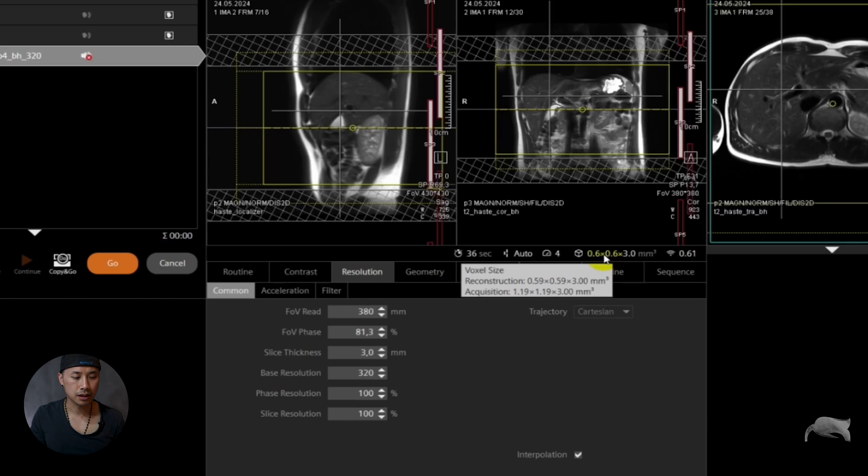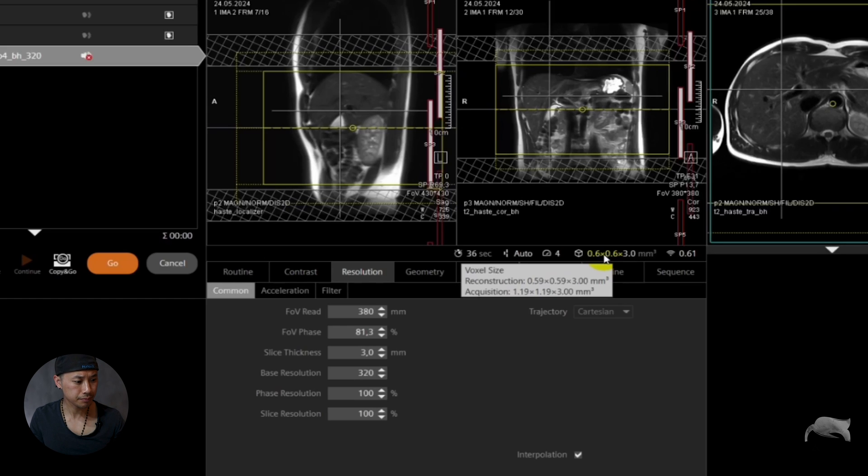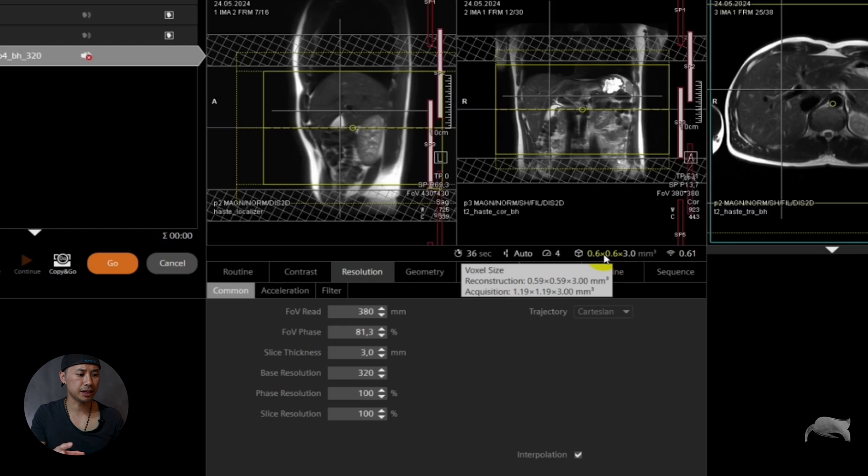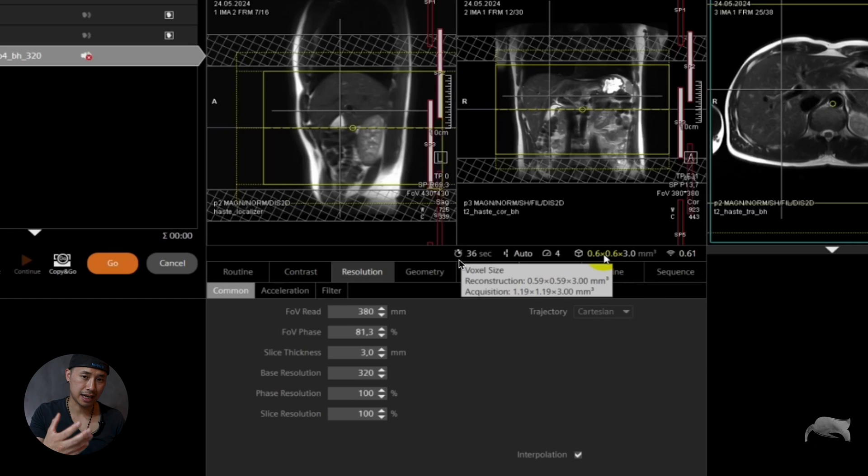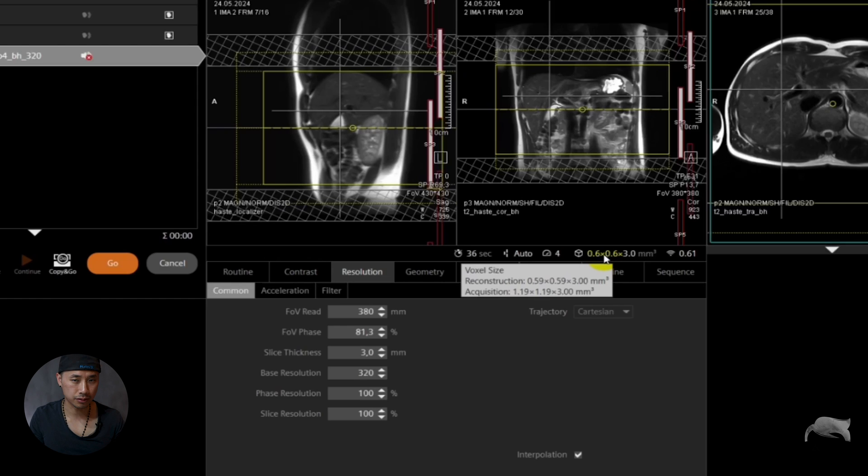The slice is only controlled by slice resolution right there on the 3D sequence. This is not available on the 2D, only 3D. So this is the best. Everything, you know, you get through everything, the voxel sizes, pixel sizes. You lose a lot of SNR of course. The scan time is so high, 36 seconds. Who in the world can do a breath hold for that long? Of course some can, but mostly can't.